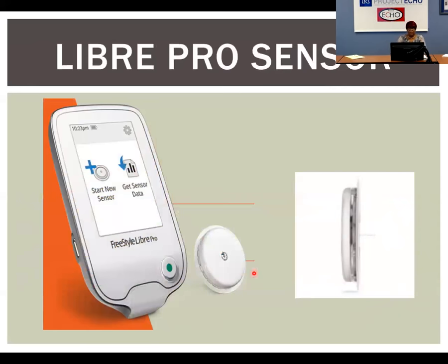So with the Freestyle Libre, as I said, it's got a much smaller catheter on it. And as you can see on the screen here, when you're ready, once you have placed the catheter, it's a simple matter of pressing this Start New Sensor button, and it will say, are you ready to activate a new sensor? You tap the yes that appears on the screen. It tells you you need a 2-minute warm-up, so that you sit and talk to the patient for 2 minutes. You wave your magic wand over the sensor, and it activates it, and the patient is good to go.